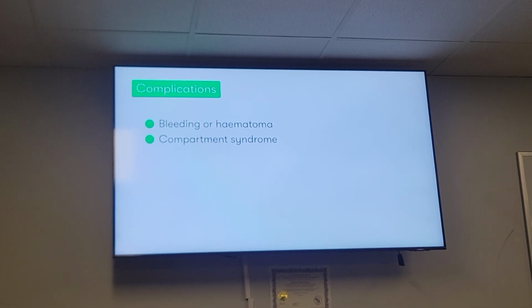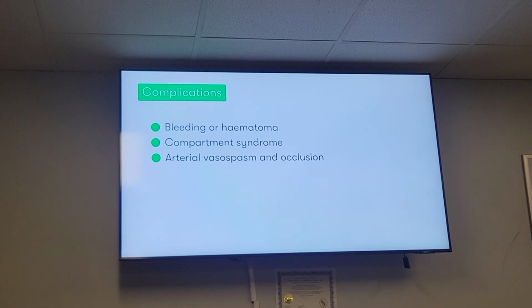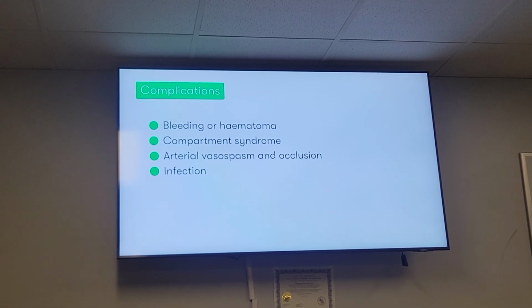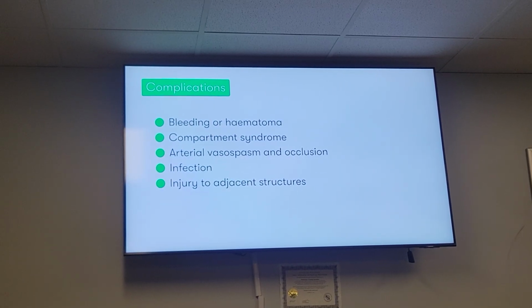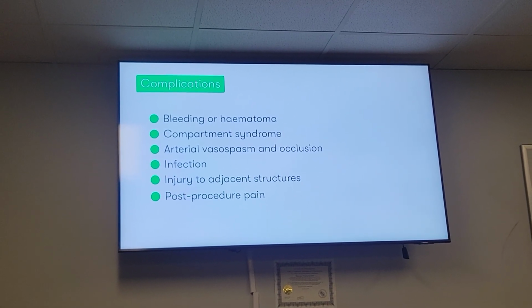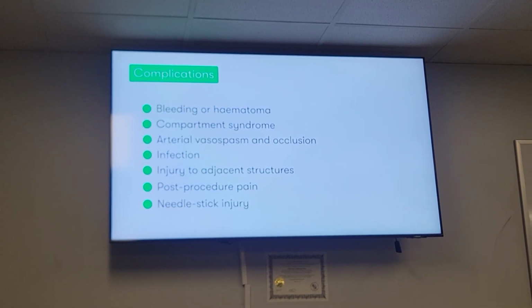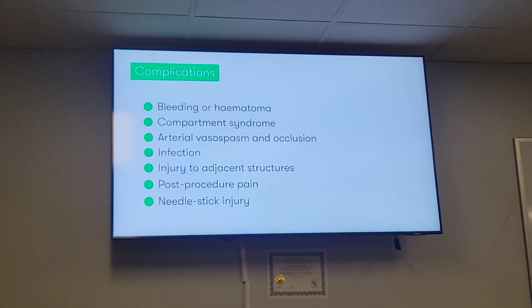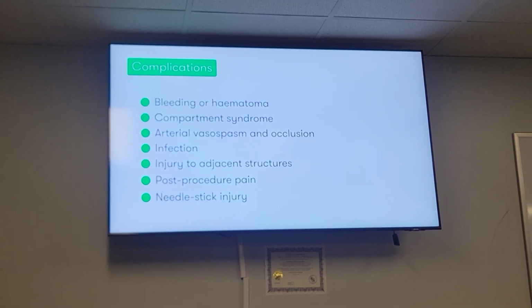Other complications to be aware of include arterial vasospasm or occlusion, infection at the puncture site, and injury to adjacent structures such as nerves or tendons. The patient may experience significant post-procedure pain. And lastly, there is the risk that the person carrying out the procedure may sustain a needle stick injury. So make sure you take all necessary precautions at all times.